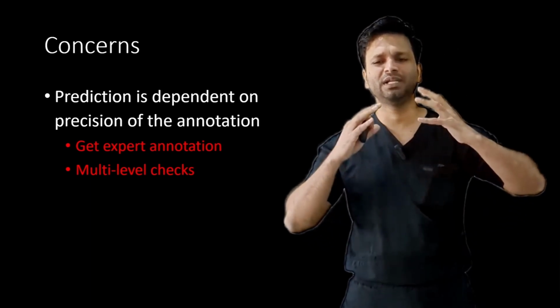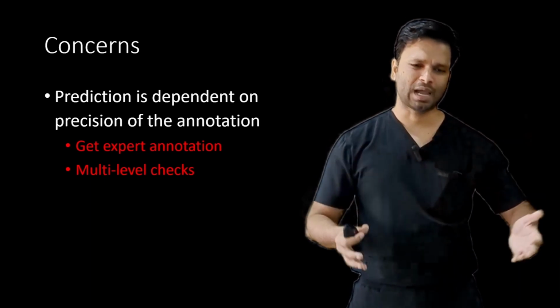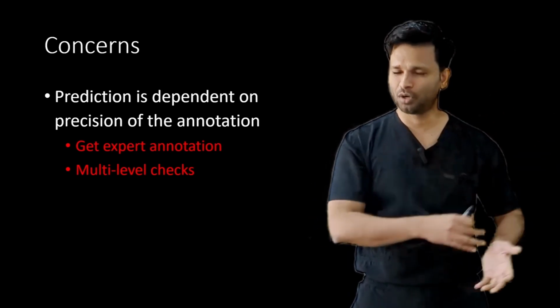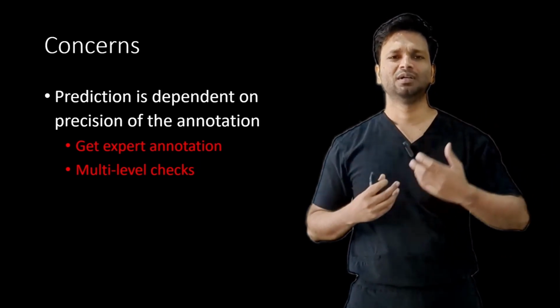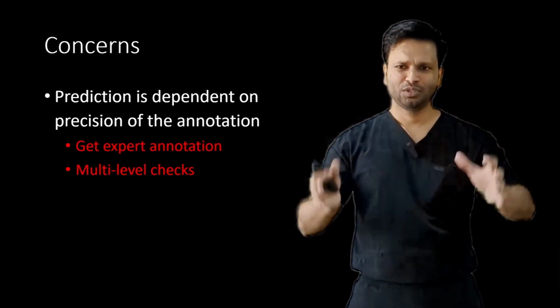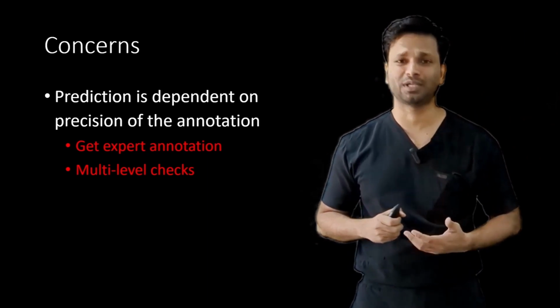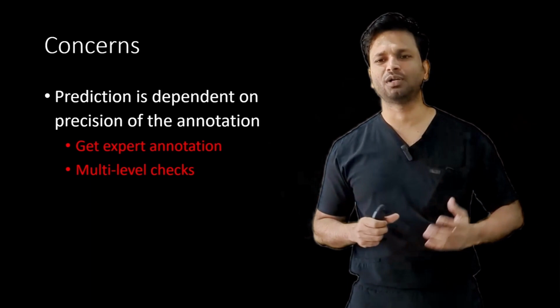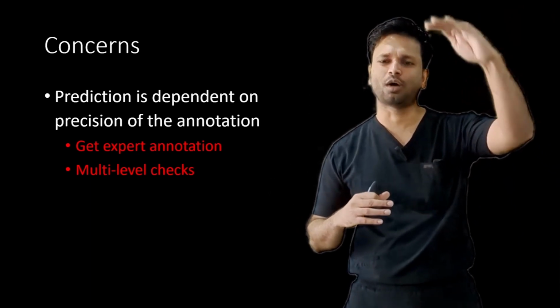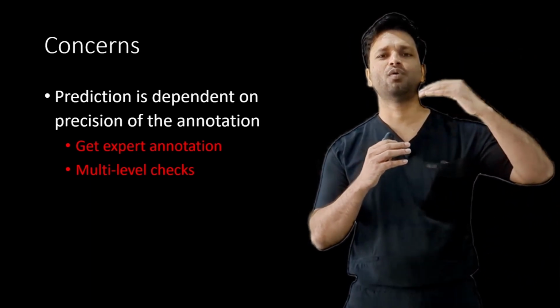For that, we need an expert in that field to annotate the data. Ideally, the radiograph should be annotated by a radiologist. Clinical images of perio cases should be annotated by a periodontist. Clinical cases of caries or periapical lesions can be annotated by an endodontist. So you need an expert for all of these annotations. But it is going to be costly to hire an MDS to do all of this annotation. So the system currently followed is that these companies hire dental graduates to do the annotation, and an expert sits at the top level to review their annotations and approve them. So it is still being overseen by an expert.